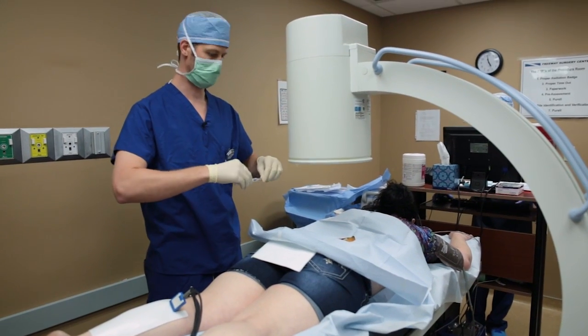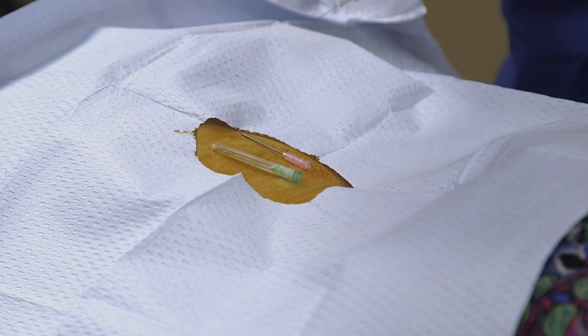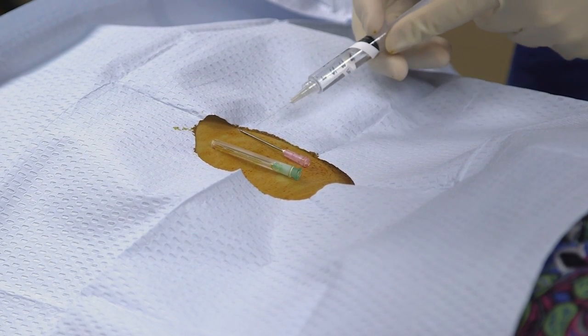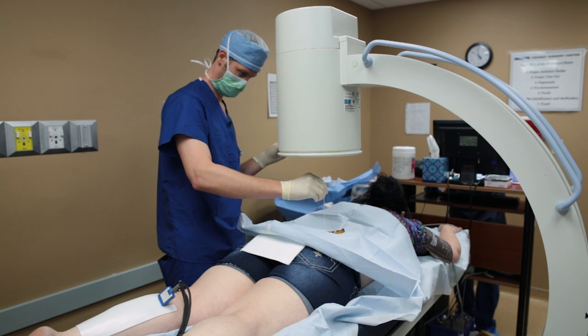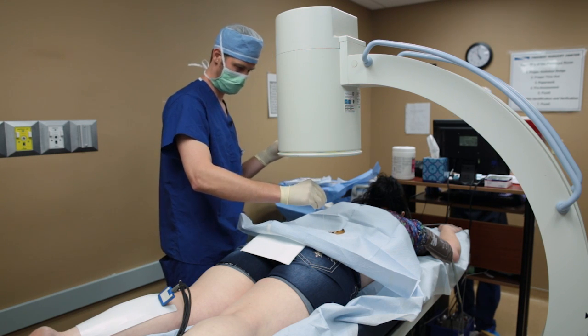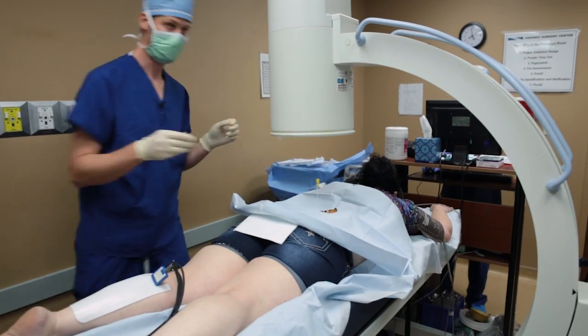There will be multiple needles placed during this procedure, and prior to placing the needles we'll put some numbing medication in the skin — a little poke and a sting. Next we'll put the needles and we'll use x-ray to get them to the right spot so we can burn those nerves that innervate that painful joint.